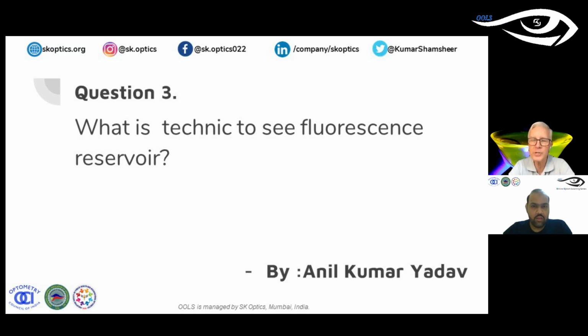When you want to see the entire eye at once, then that's when you put in your cobalt blue filter, and you can add a Wratten over the top, and that'll light up the whole thing. But for the optic section, you use white light.